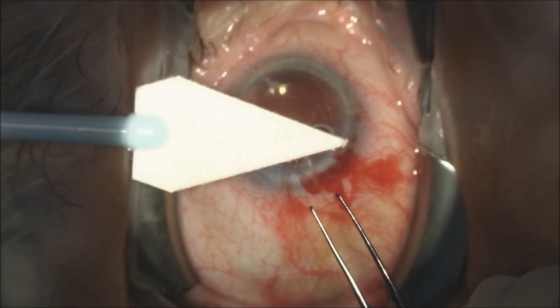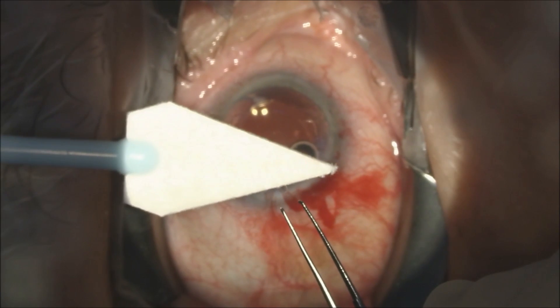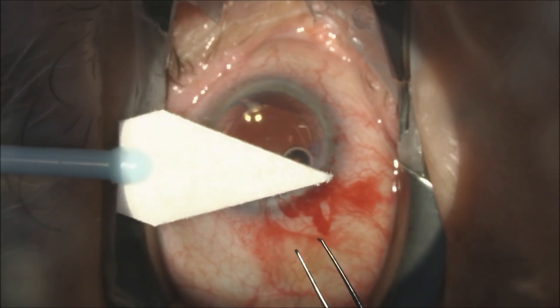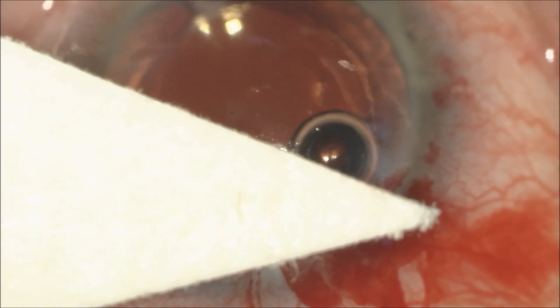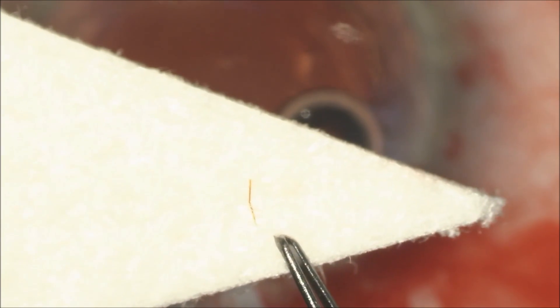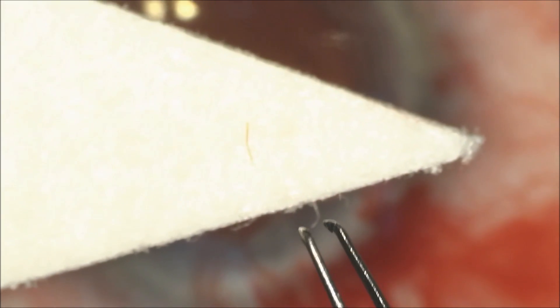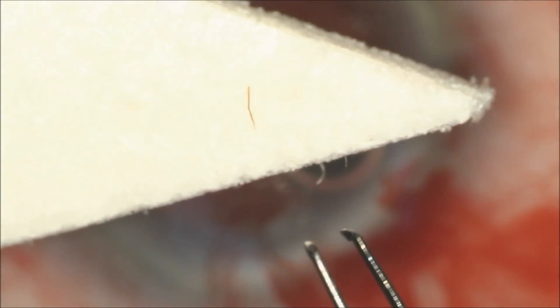We will leave this in situ as it's not causing much corneal inflammation. You can see we've removed the bee stinger from the clear cornea wound through the inside of the eye. You can see it demonstrated here on a Weck-cell sponge, and we have taken the bee stinger from the inside of the eye and completely removed it in one piece using these fine capsulorrhexis forceps.